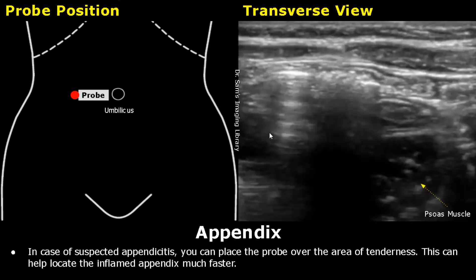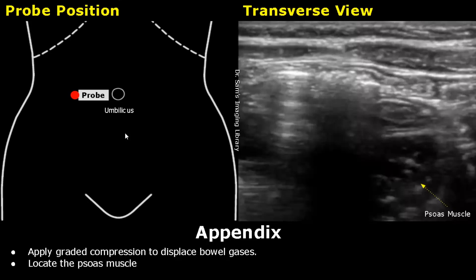In case of suspected appendicitis, place the probe over the area of tenderness. This helps in locating the appendix much faster. The patient can help you in placing the probe over the area of maximal tenderness, though this method is not always reliable. Next, apply graded compression to displace bowel gases.